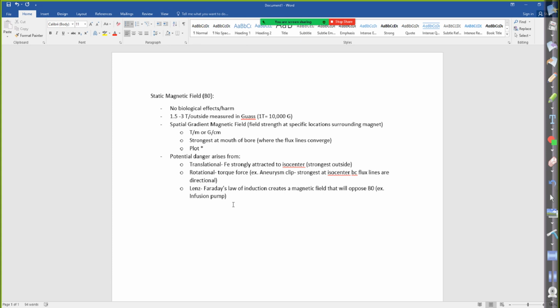Okay? So that summarizes the static magnetic field. Let's move on. RF, B1.